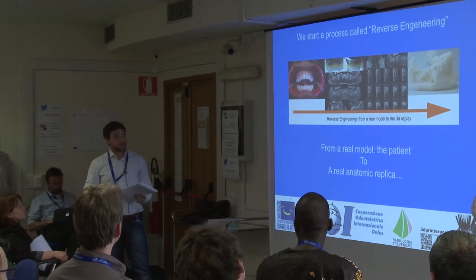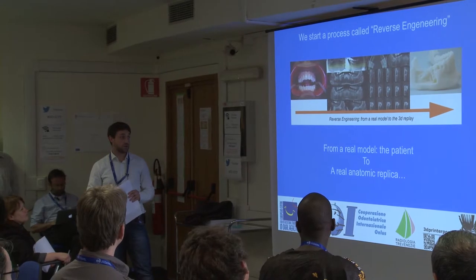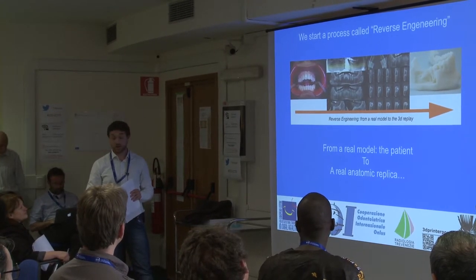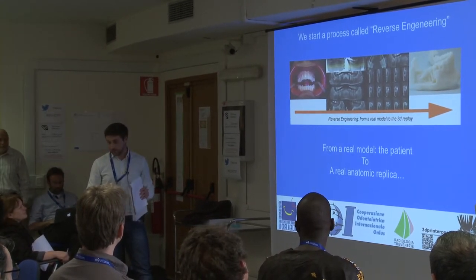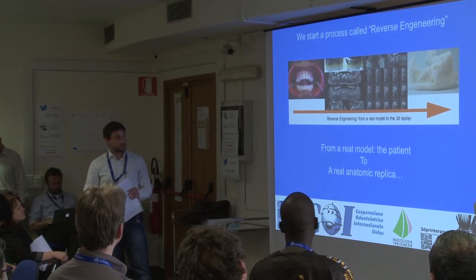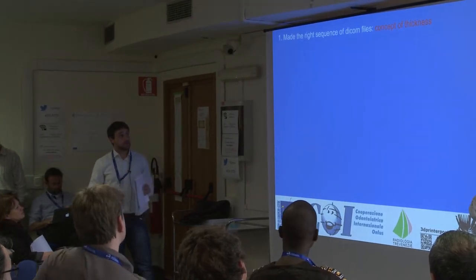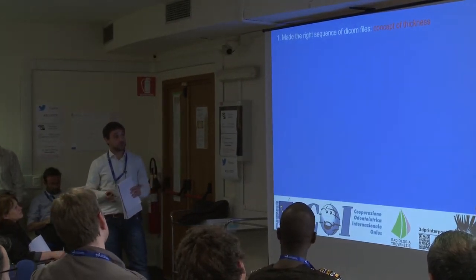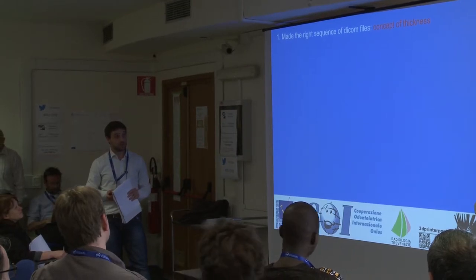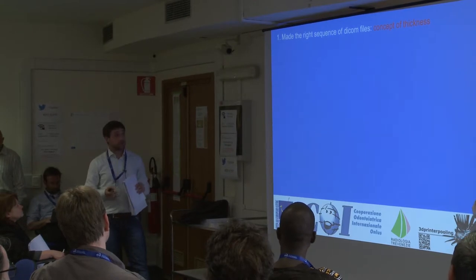This process, called reverse engineering, is a process that goes from a real model, the patient, to a real anatomic replica, passed through the CT data. I try to divide the concept of reverse engineering into three steps.